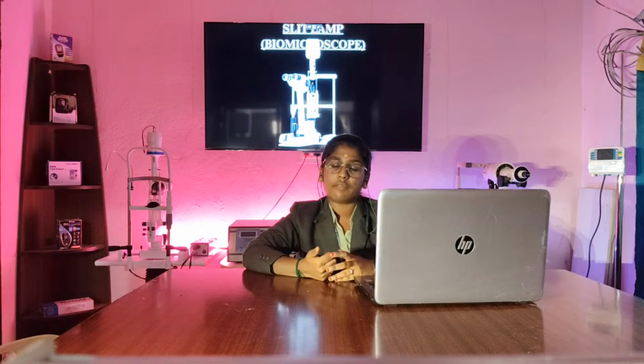The light system used in the ophthalmology department, for all kinds of imaging and detecting techniques, is a common light system with an LED bulb, because some people are sensitive and cannot tolerate high amplified electrical signals or high amplified illumination.